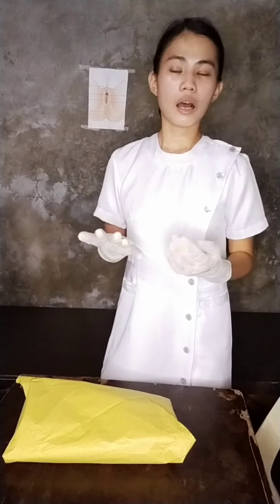But before that, you need to review the medical records or the pathological condition of your patient that may impair the passage of the catheter. Next, you need to verify the doctor's order. This procedure is indicated for urinary retention and continuous bladder irrigation, and it can be used to provide more hygienic care to the bedridden patient.